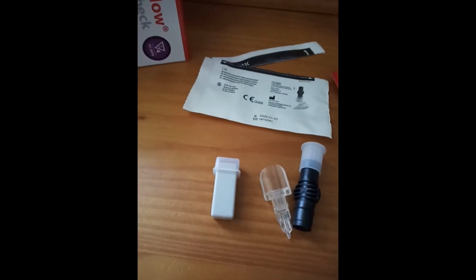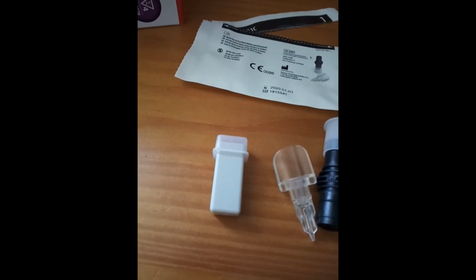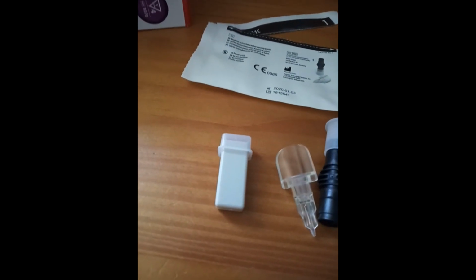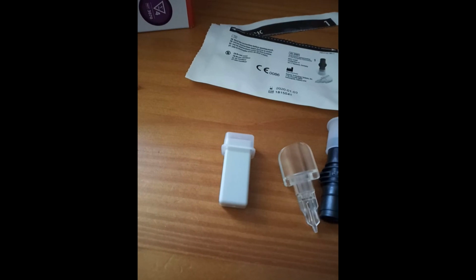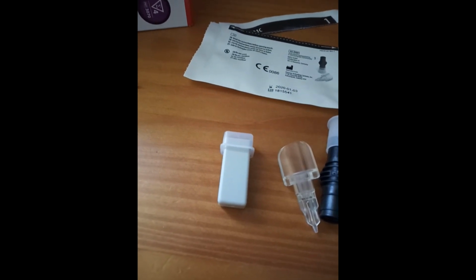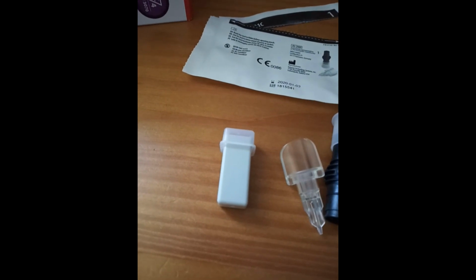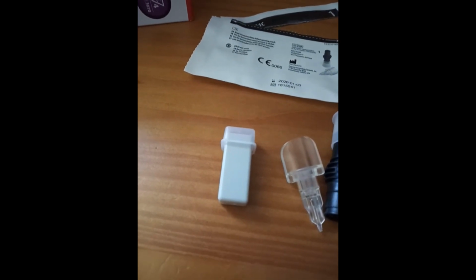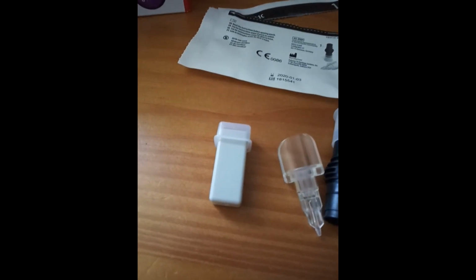Okay, so I've watched the video, and that did not explain what that bit is. So I had to go back to the leaflet. Imagine that, reading the instructions. So there it is, the Lancet. If you've got your own preferred lancing device, you'd use that instead. But as a person without diabetes at all, I don't have a Lancet, and I'm loath to use my daughter's. So therefore, here we go.